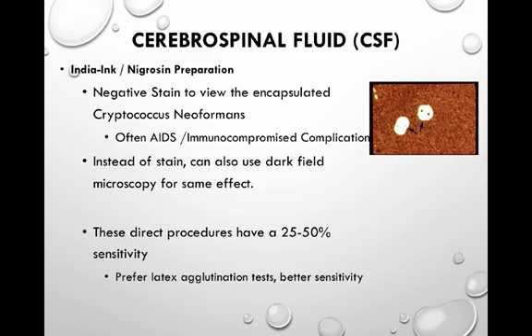Kind of an outdated test that is performed is something called the India ink stain, or nigrosin stain prep. This stain prep is used to identify Cryptococcus neoformans.